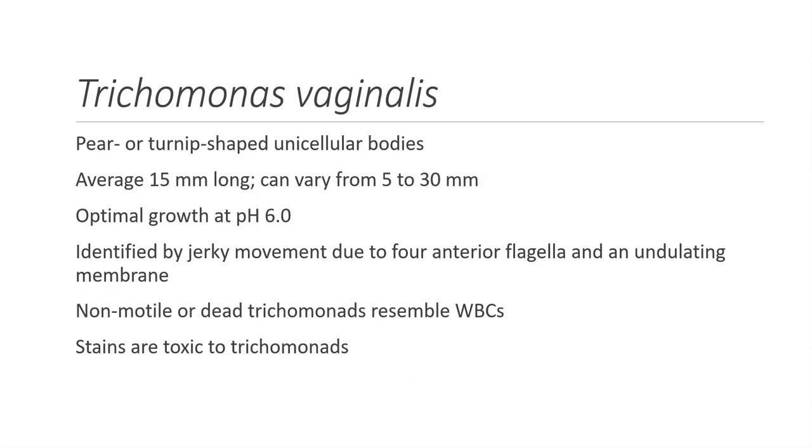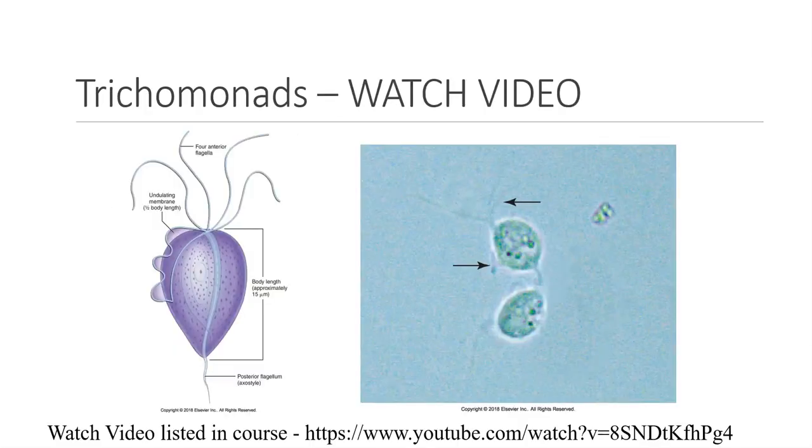And they're really cute. I've seen these many, many times. In my microscopic examination, it's like they go to this little piece of debris and then move over to this little piece of debris. And it's a jerky movement. A lot of times you can actually see the flagella. I've listed a little video for you to watch that shows many different microscopic videos of Trichomonas vaginalis.